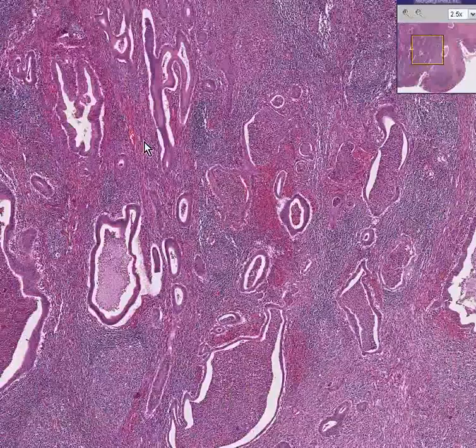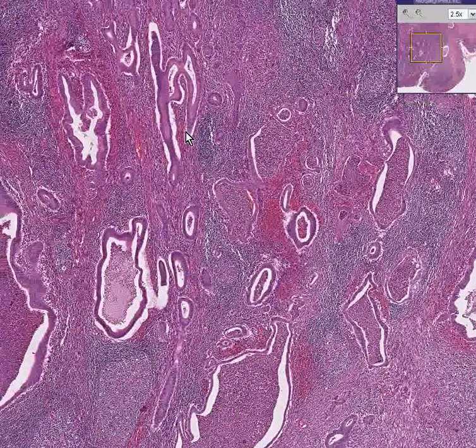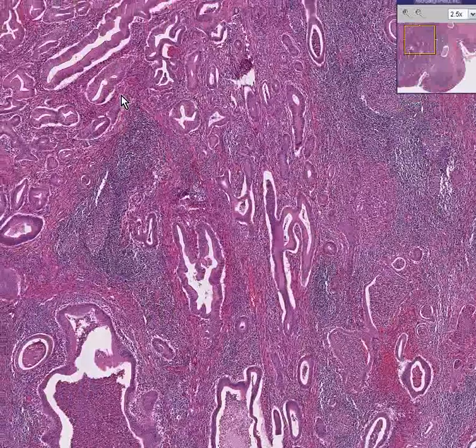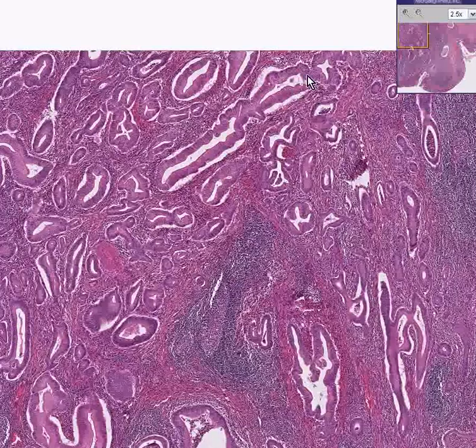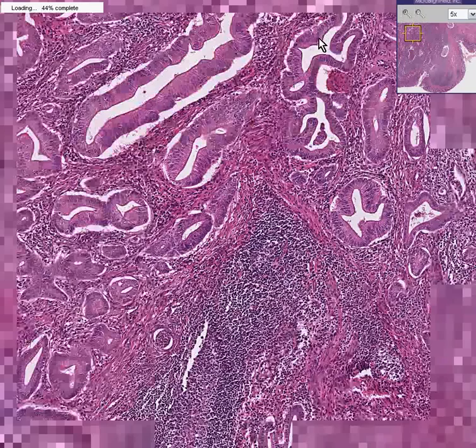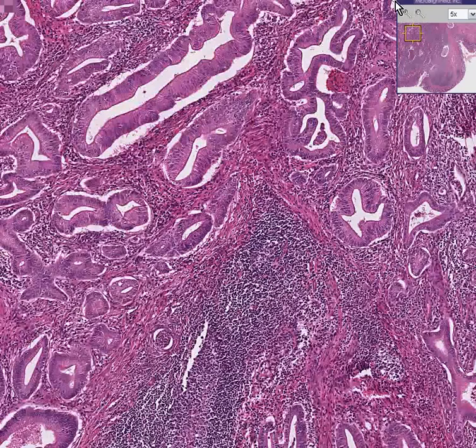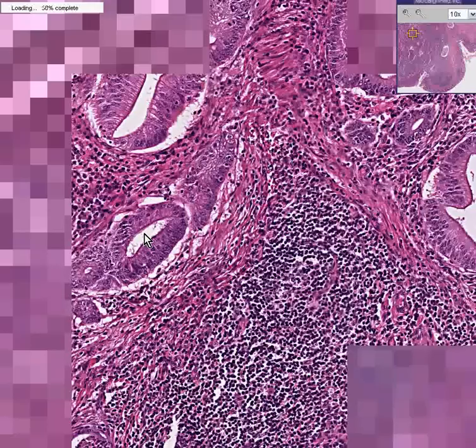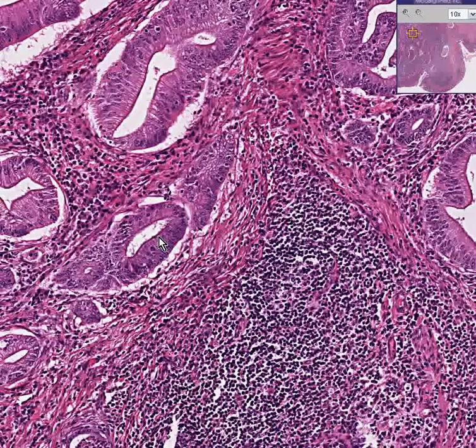This is cancer. This is an ulcerative colitis that not only has atypia within the mucosa and ulceration, but it also has these downright malignant, irregular infiltrating glands deep to the mucosa as well.